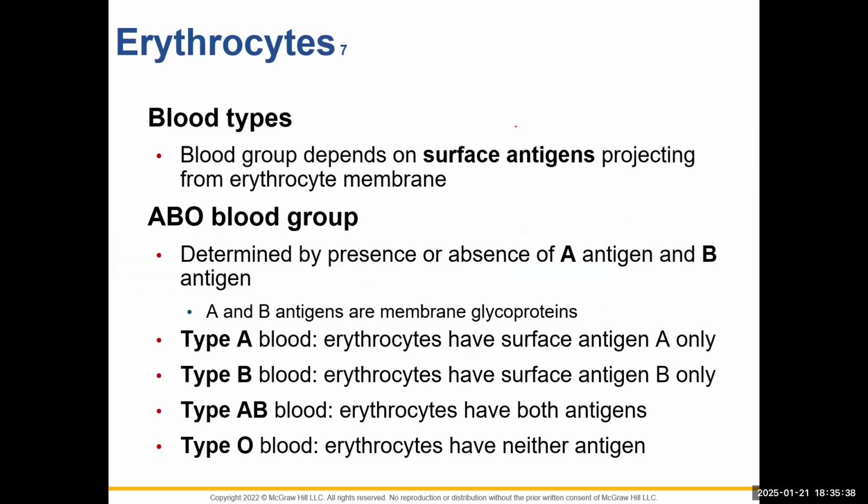All righty. Let's talk a little bit about blood typing. The last part that I'd like to discuss with you in regards to the blood chapter for lab is going to be about the erythrocytes specifically, but about blood typing.